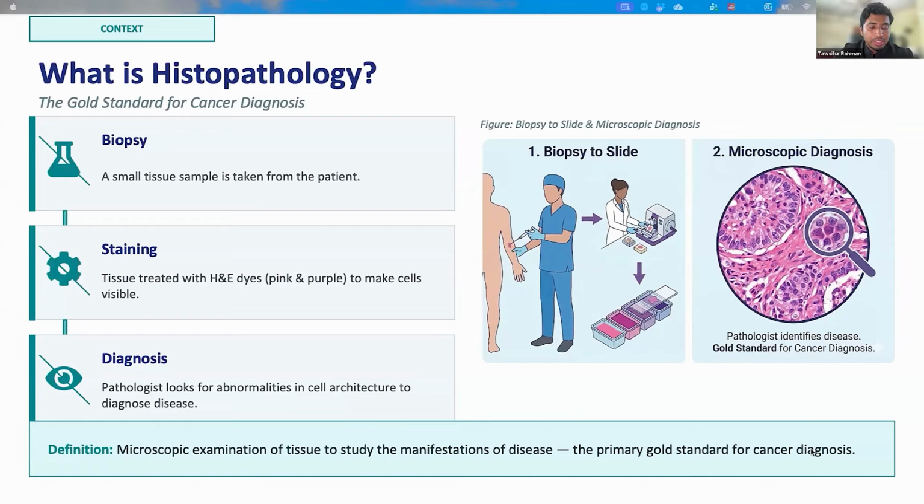What's important to understand is just how expert-intensive this process is. It takes years of experience for the pathologist to find this abnormality in the tissue. And it's also very variable. Different pathologists have different opinions on the same slides or the same images. So that's exactly where I think AI can add value, to assist the pathologist to scale and make the process more consistent.